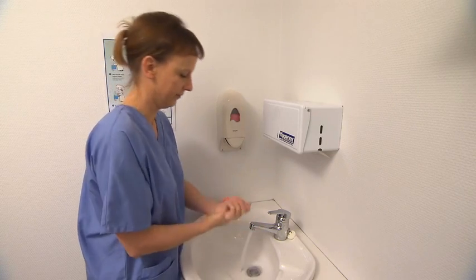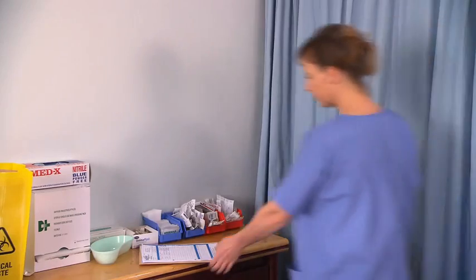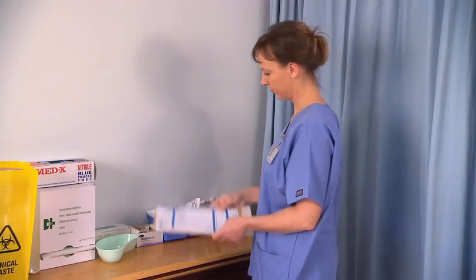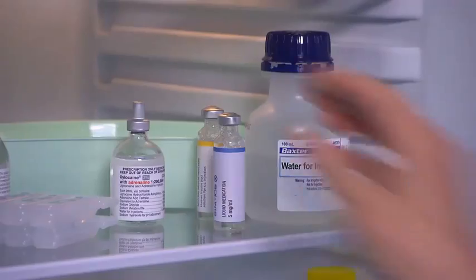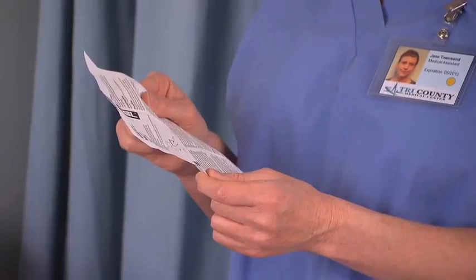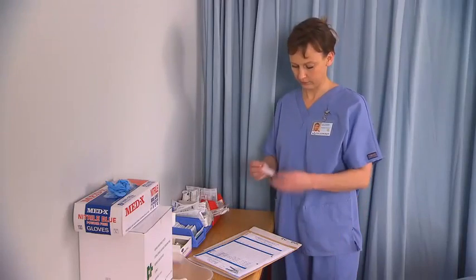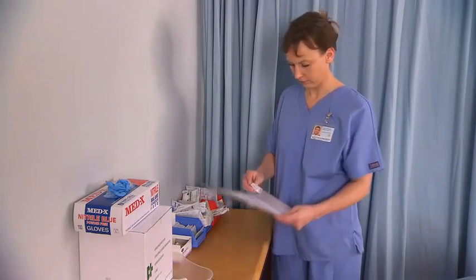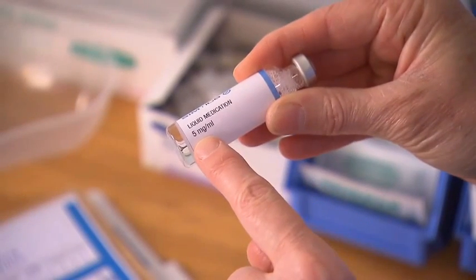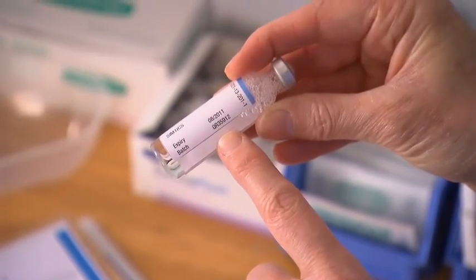Wash your hands and set up a tray with the required equipment. Review the physician's order and confirm the correct medication and technique. Remove the medication from storage and warm if necessary. Check the administration profile from the manufacturer's insert. Conduct the first medication check against the physician's order, checking the medication name, the dose and unit of measure, as well as the expiration date on the vial.